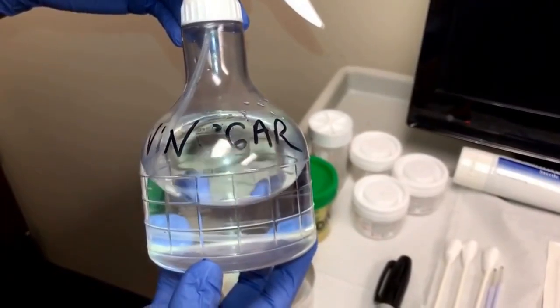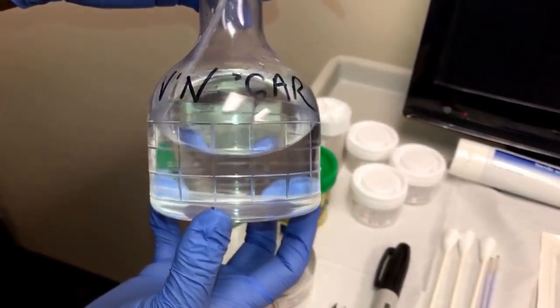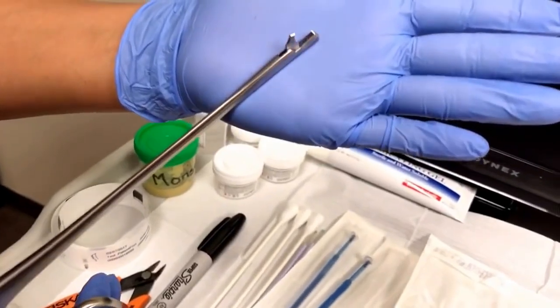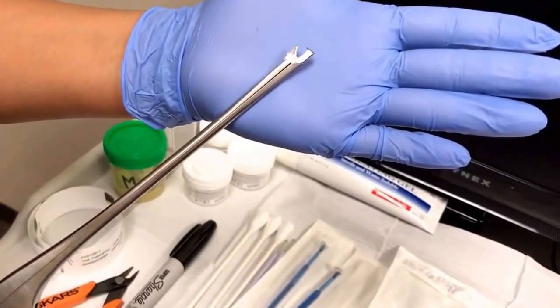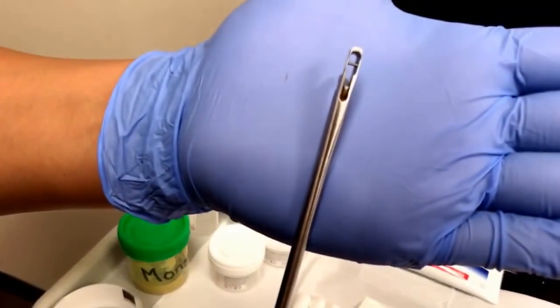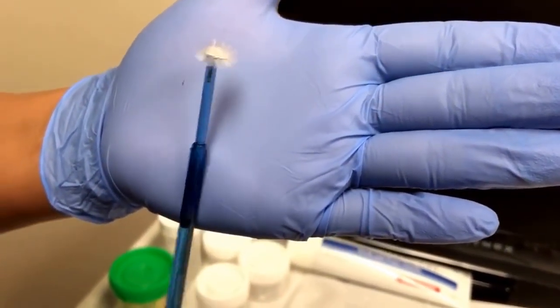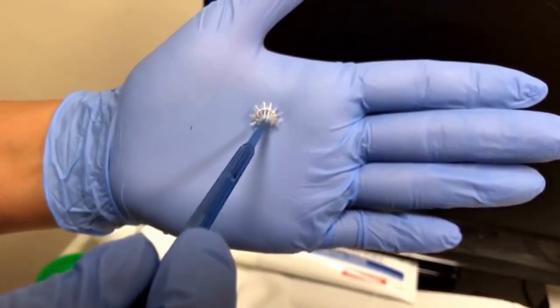This vinegar solution is used by the provider to highlight any areas of concern, which will then be biopsied by the provider. The provider has two methods of obtaining a biopsy. This one moves in this fashion and the biopsy would be collected in the bottom and shaken off into the vial. There is also this method here, which has bristle-like ends and would be used in this fashion onto the cervix.